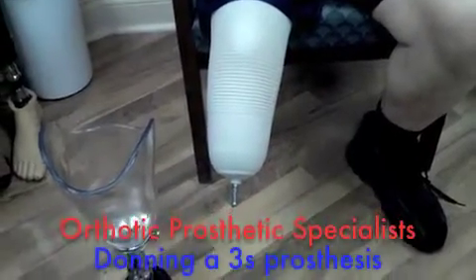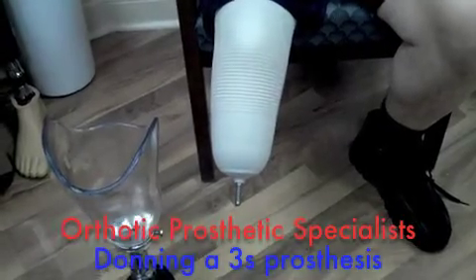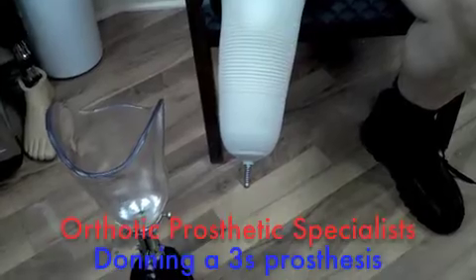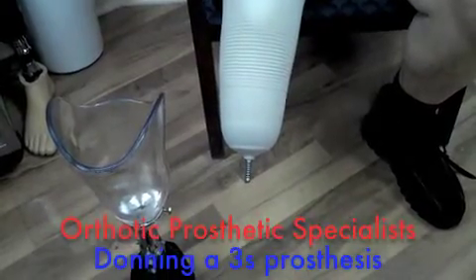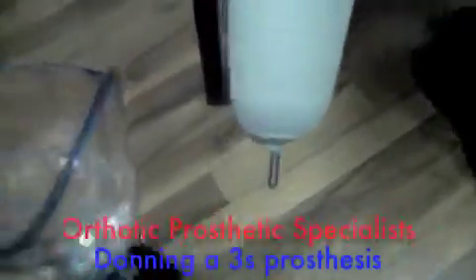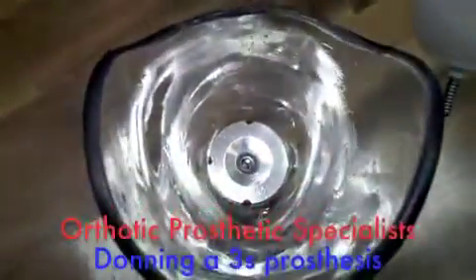This video is going to show the donning of a 3S prosthetic system. When donning a pin suspension below the knee prosthesis, the key is to orient the pin so that it will be guided towards the shuttle lock in the bottom of the prosthesis.